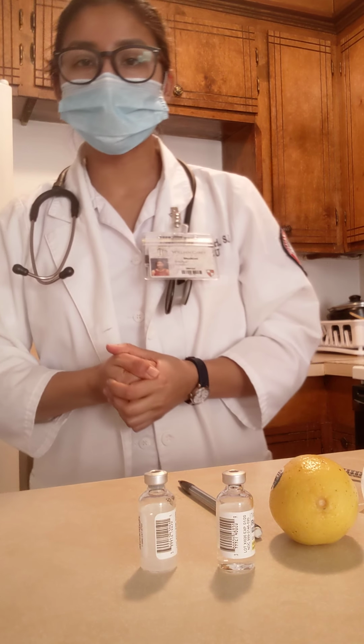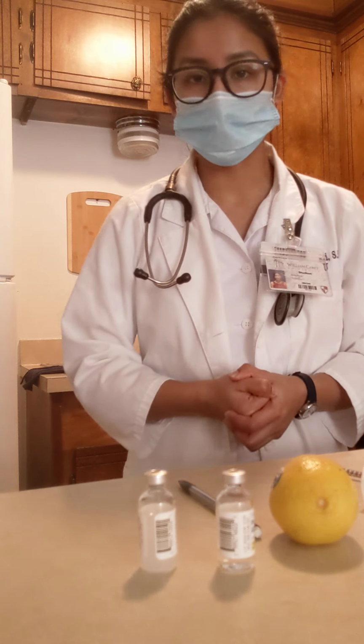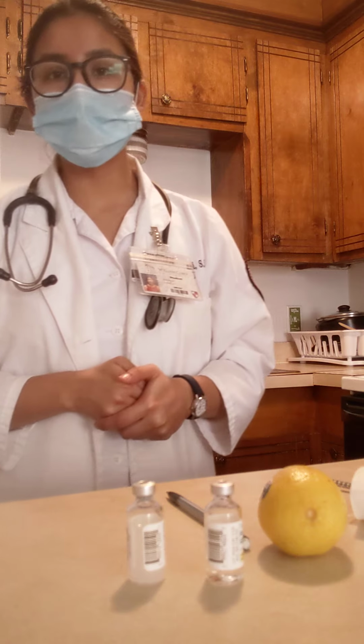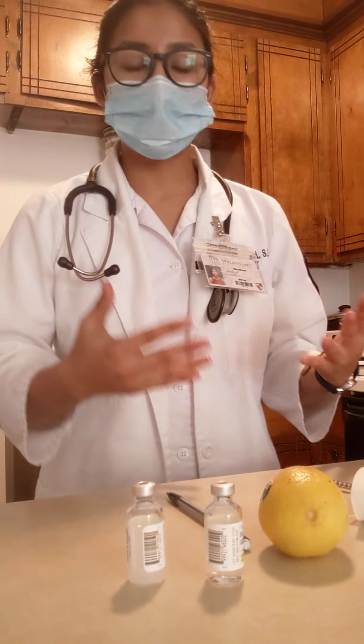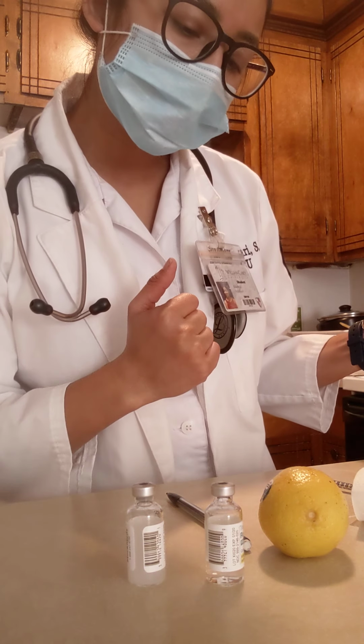Good morning. Today's video is going to be about blood glucose monitoring and insulin administration. The first part of the video I'm going to do blood glucose monitoring. So I'm going to verify my order from the physician with the MAR, and I'm going to identify my patient by their last name and the date of birth, January 1998.